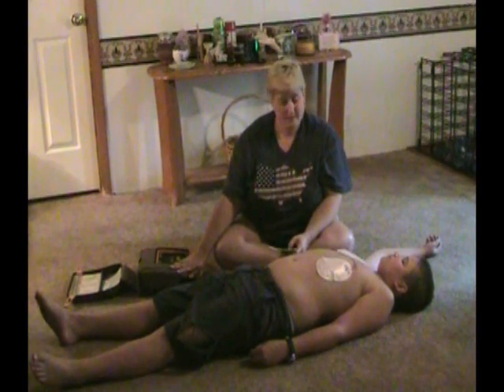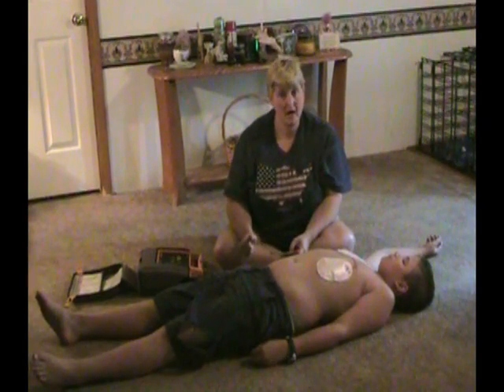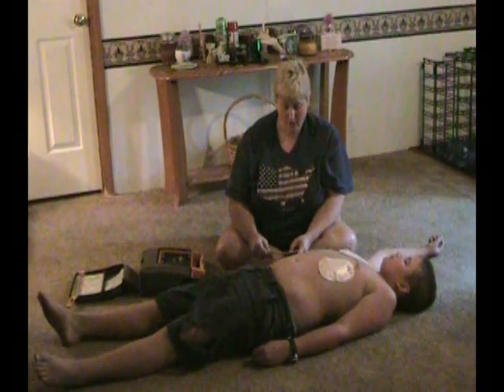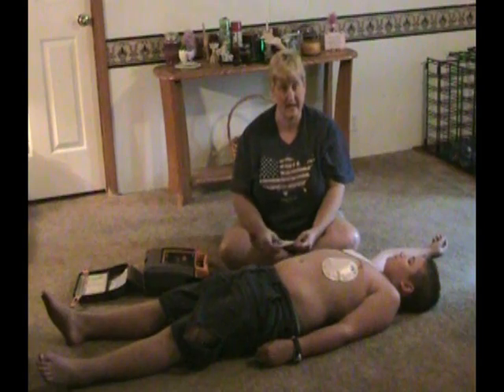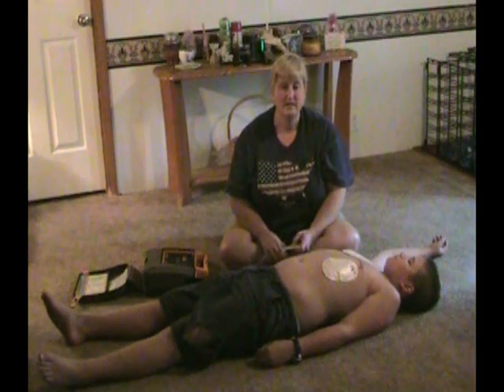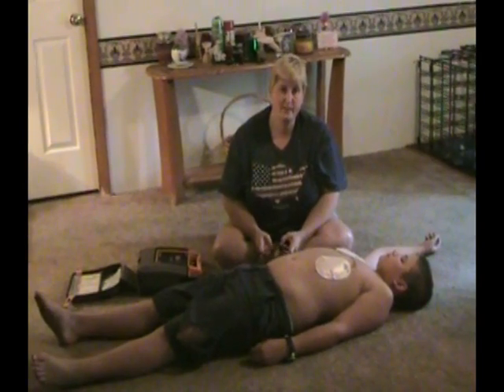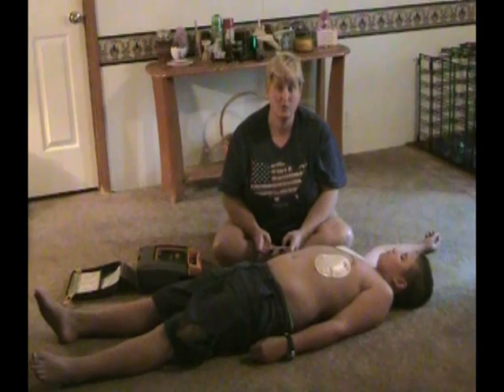We've covered the steps of what to do when we find an unresponsive victim. We quickly call 911, retrieve the AED, check for breathing and pulse, apply your pads, and then of course follow the commands of the AED. During the time it took me to give this speech, 21 people went into sudden cardiac arrest, and 7 of those will not survive.